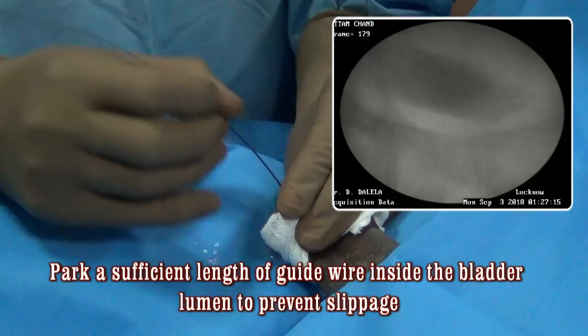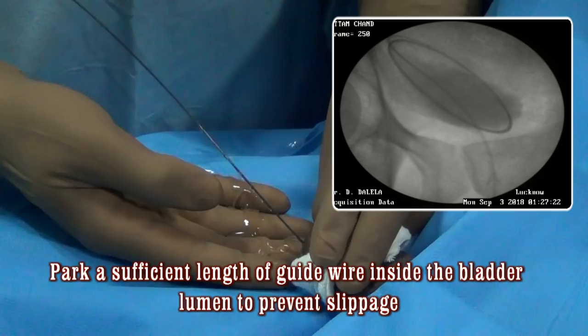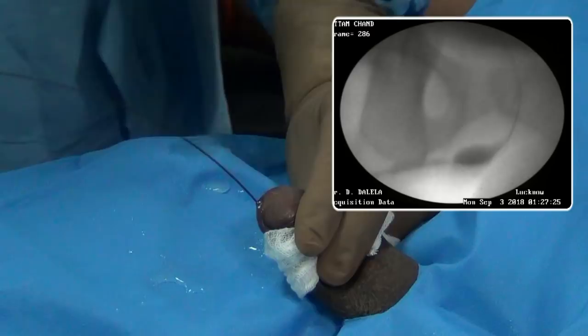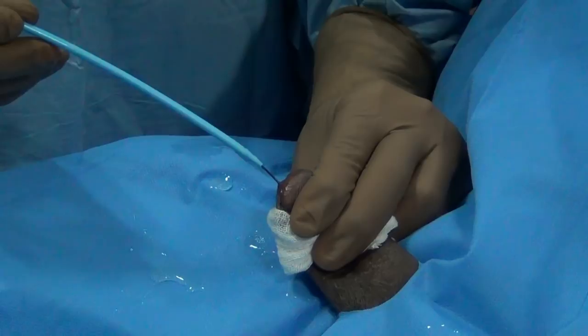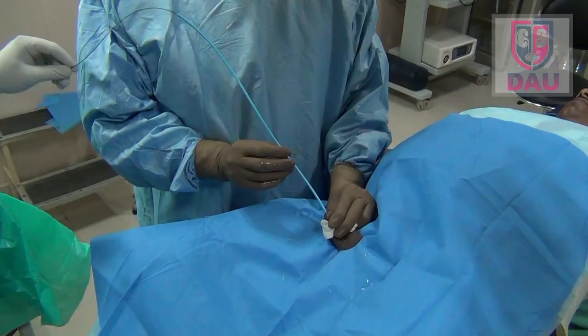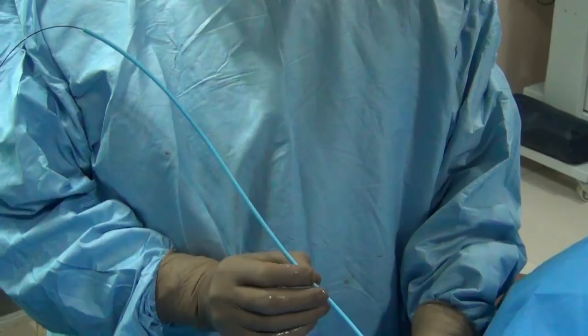The extra contrast is ejected out and now you are ready for dilatation. Lubricate the urethra with lignocaine gel once more, and then over the guide wire pass the first dilator, which is the 8 French urethral dilator. While dilating the stricture, with the left hand pull the penis toward yourself to straighten it, and in a straight penis advance the dilator over the guide wire.